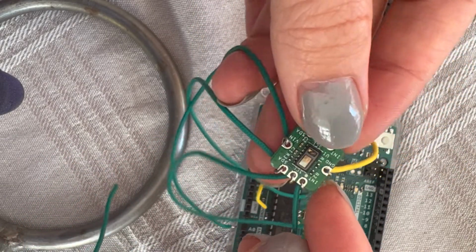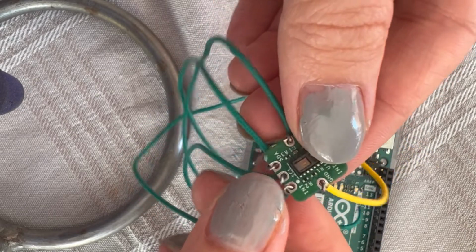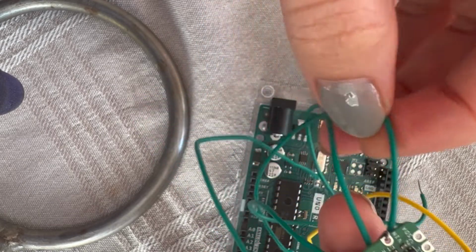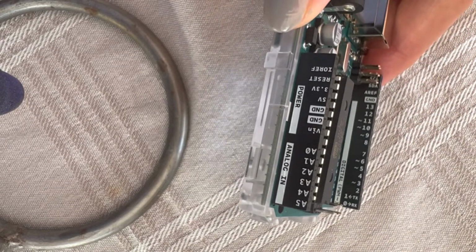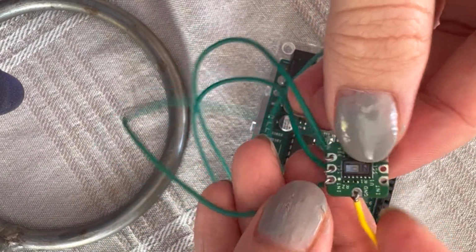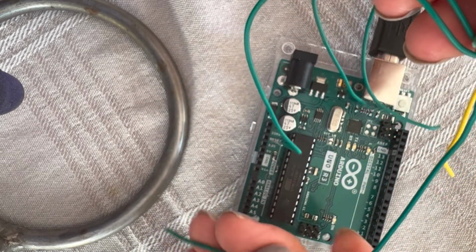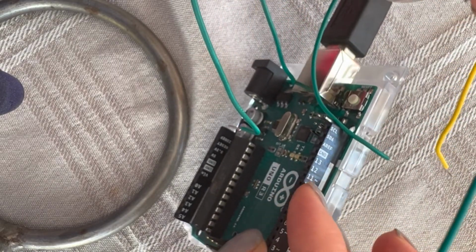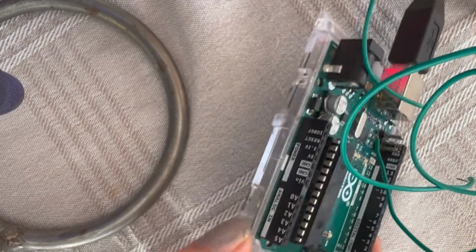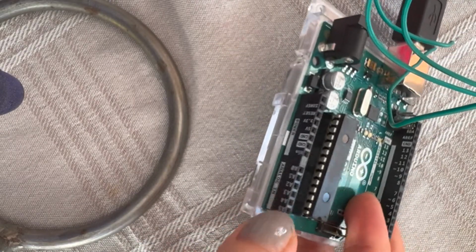So this one has the same pins on these two sides, any of them you can use. So one is the ground, GND, and the yellow one, and then this one is VIN. So this VIN will be connected to VIN on the board itself here, and the ground goes here, and we have the three others. There is one, I don't know, is it INT? Whatever it is, this one connects to number 10, and SDA is connected to analog pin A4, and SCL is connected to analog A5 here.